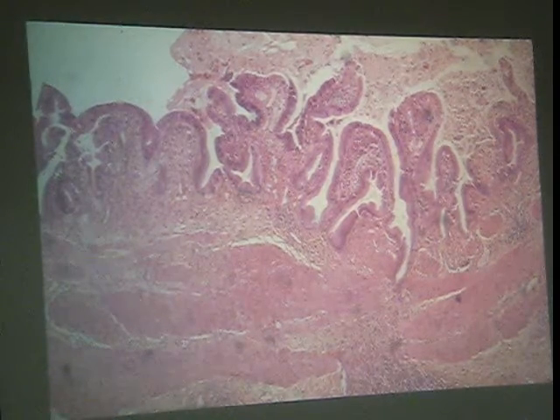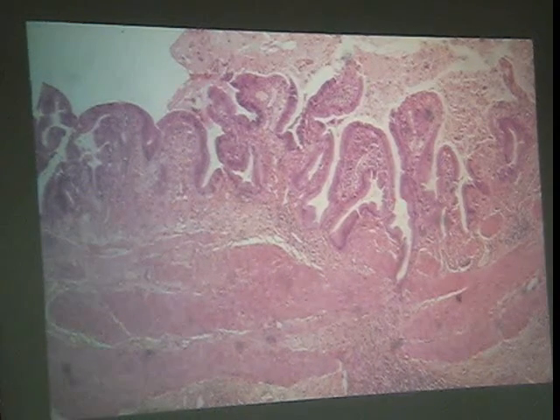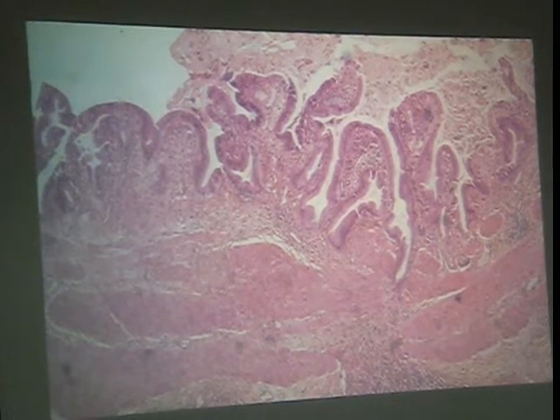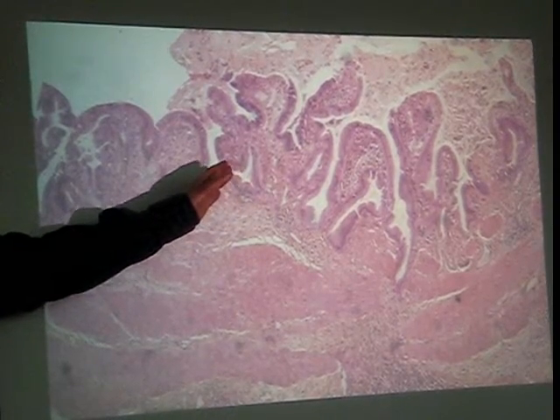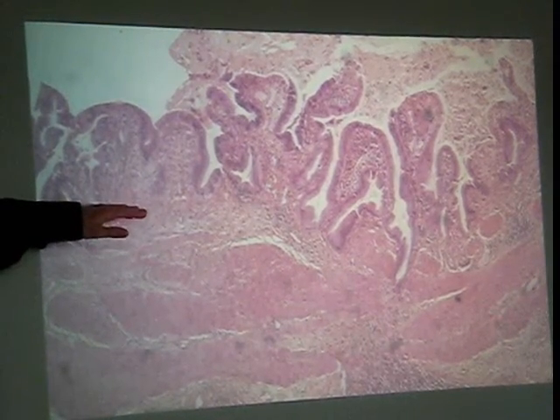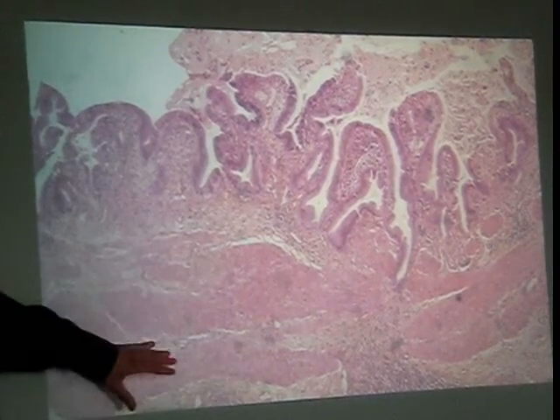But now let's apply some histologic terminology. These little squiggly things look kind of like folds, or like villi. Yeah, you get away with that. I mean, that was creative. I'll go with it. But what's lacking in the epithelial lining? Goblet cells, exactly. And then the other thing is you don't have a muscularis mucosa. You basically have the lamina propria sitting right on top of the muscularis.